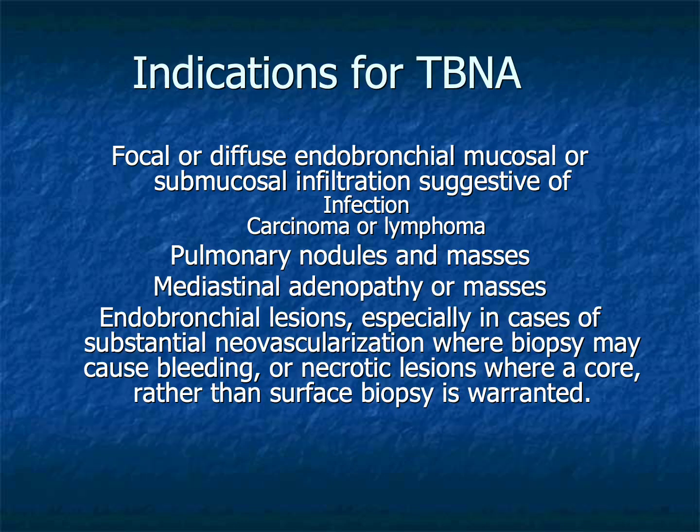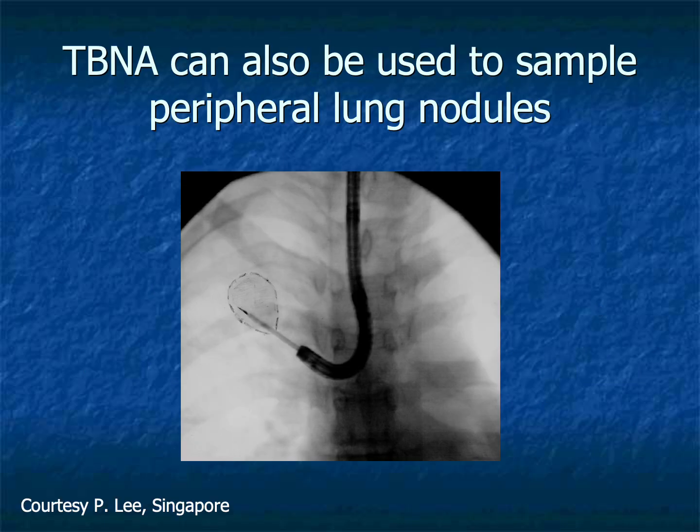However, its applications extend well beyond cancer staging. Needle aspiration is also useful for evaluating mediastinal masses, diagnosing submucosal airway lesions, sampling endobronchial tumors, and obtaining tissue from lesions where conventional forceps biopsy may be hazardous because of excessive vascularity or surface necrosis. With appropriate guidance, conventional TBNA may even be used to sample selected peripheral pulmonary nodules. Thus, needle aspiration should not be viewed as a niche procedure, but rather as a versatile extension of diagnostic bronchoscopy.